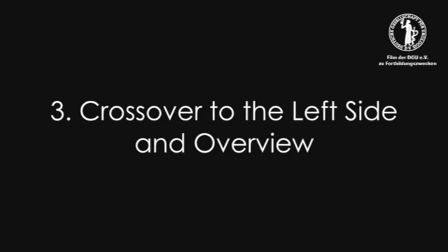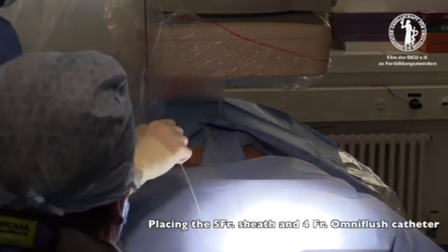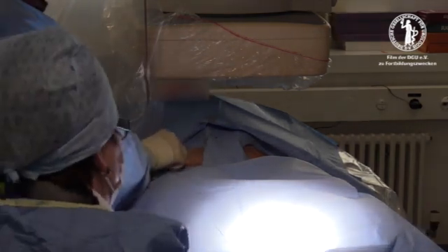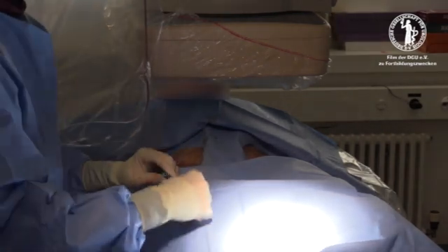Pulsatile blood flow is objectified and a five-French sheath is inserted into the vessel using a Seldinger technique with an Aterumo guide wire.